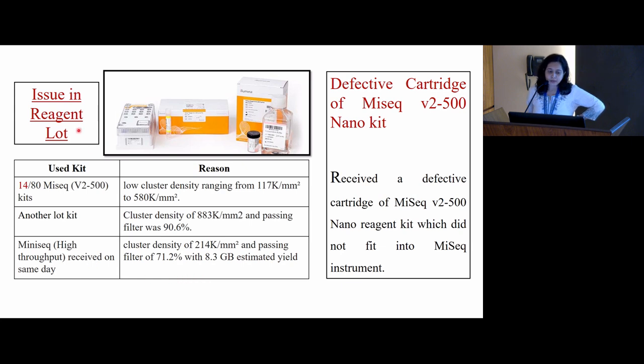Then we complained, and they checked in their system that it was a manufacturing defect in the kits. So whenever you get another lot, this is a kind of lot verification. You have to do it, and you can reduce errors in that way.